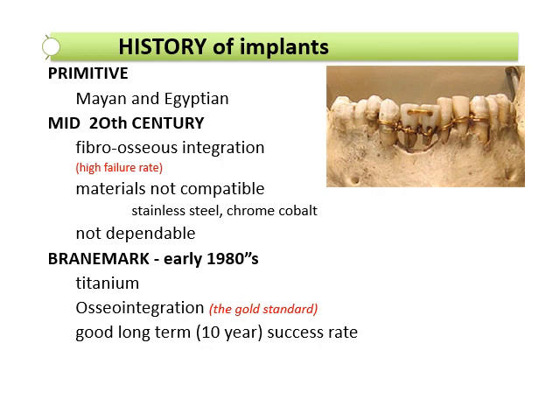They were also using materials that weren't compatible with the body. They were using stainless steel and cobalt. So these doctors were placing implants made of material that wasn't successful. The body was pushing out the fixture. The body recognizes it as not self, goes there with the inflammatory response, and kicks it out, making it not stable. There was mobility, and it didn't work.